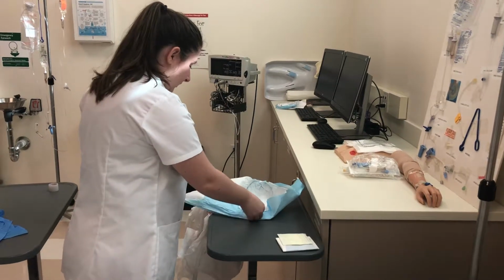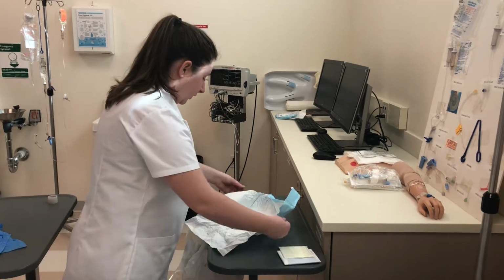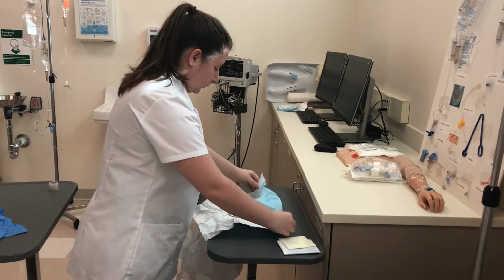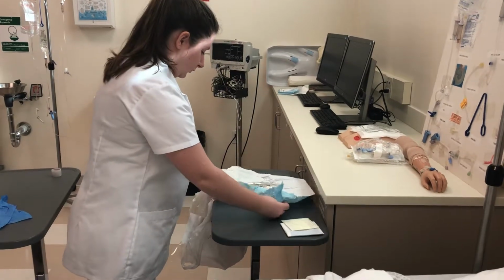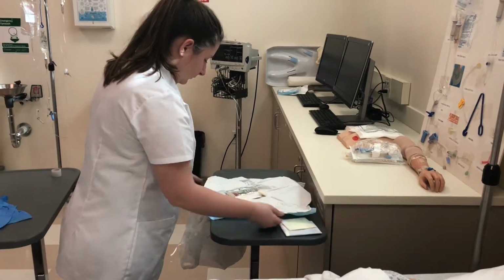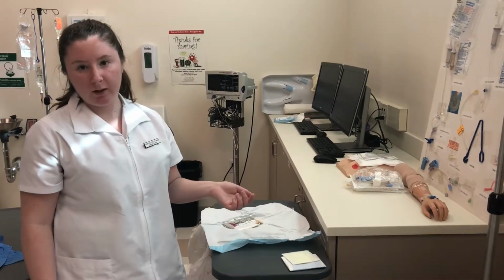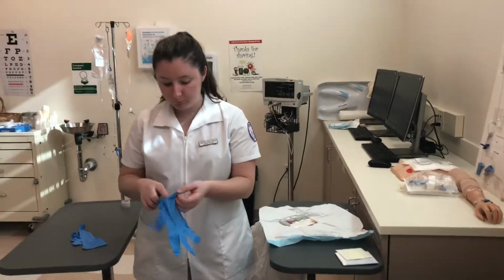And while I'm opening this up, I have to make sure that I am only touching the outer 1 inch of the sterile field. Alright, so now that this is open, I'm going to put my clean gloves on. And I'm going to wash my hands before doing so.